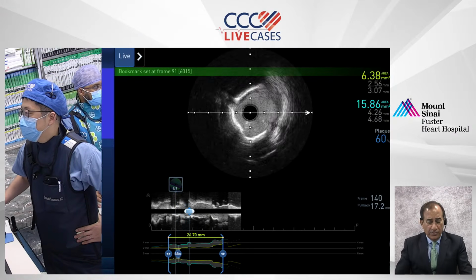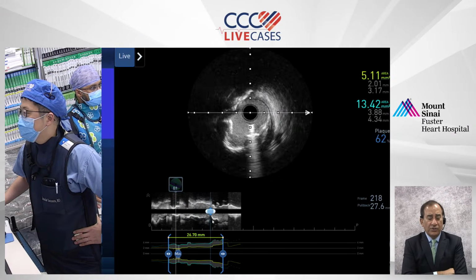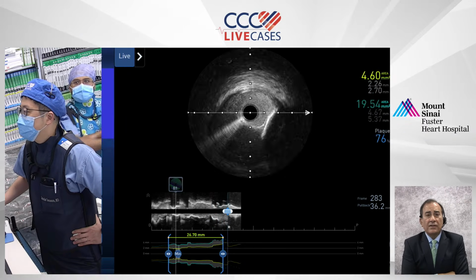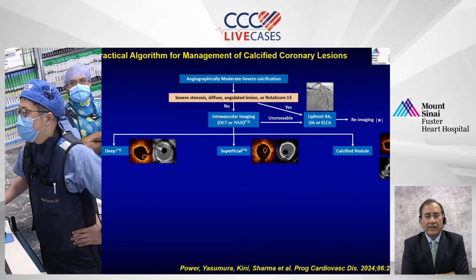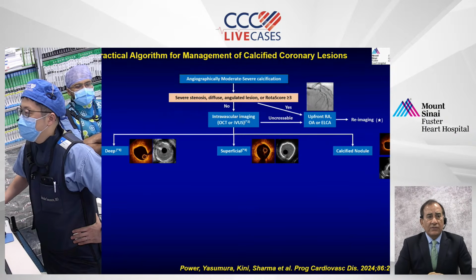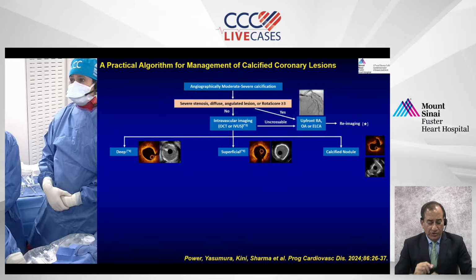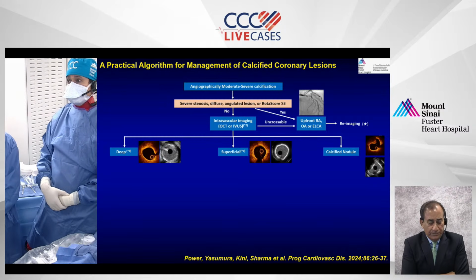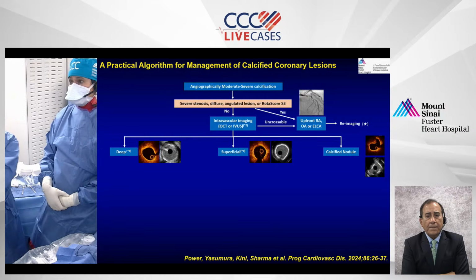Samin, many questions. I'm going to try to just give you a summary of the algorithm. Most of them are talking about the choice of ablation here, lithotripsy versus rotablation. That's one. And number two, just to let you know, we have got 33 people watching us now. I told you. Do you want to complete this so then we go to the work?